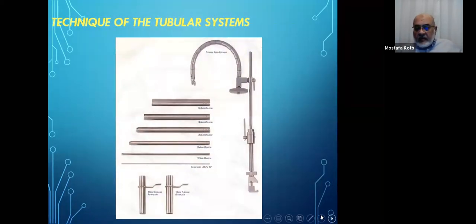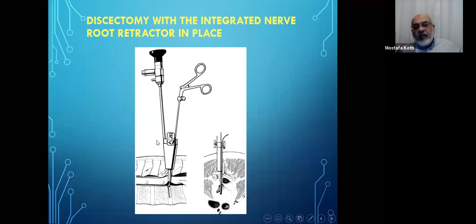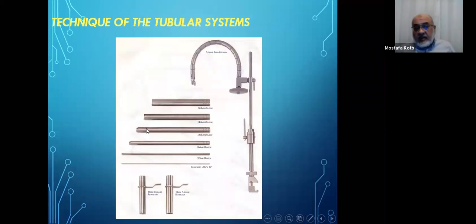The major problem with this technique is that you are confined to just straight instruments. You cannot put curved instruments through it. You cannot take out the disc from the other side of the midline. It's very difficult to tilt the tube and get the disc from the other side. And there is an area of the disc material that is not in your way. You cannot take out all of this disc. So when you have bilateral symptoms or more of a midline disc protrusion, it's very difficult to get it out with this technique. The other technique was the Metrx system that was introduced by the Medtronic company in the US at the same time.